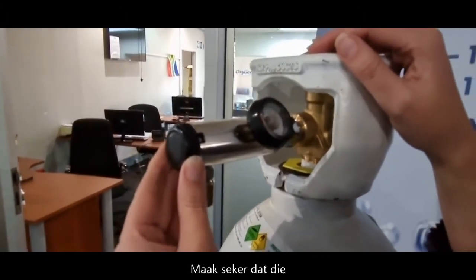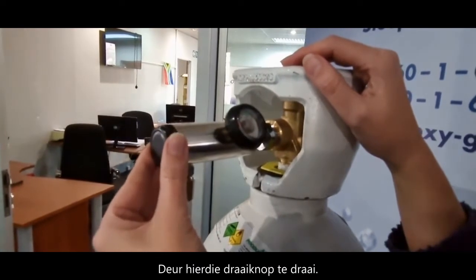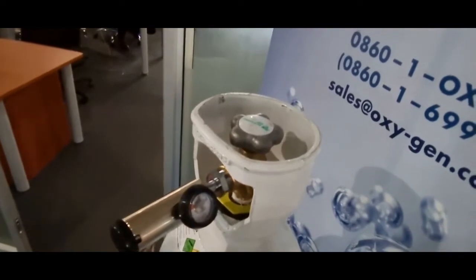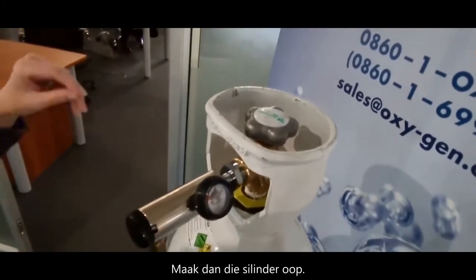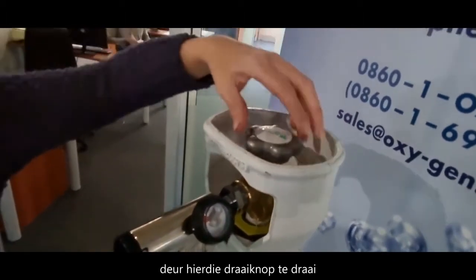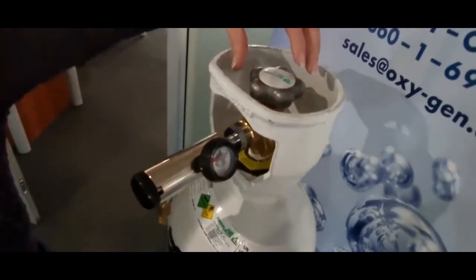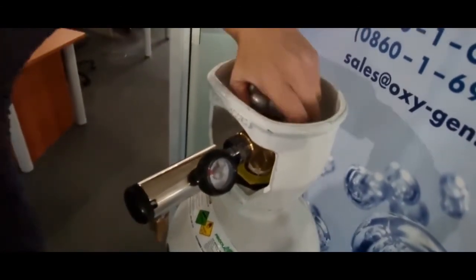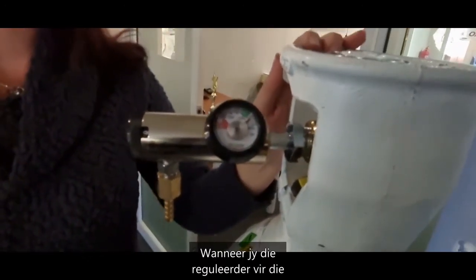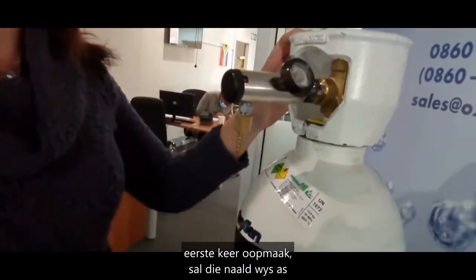Next, make sure that the regulator is on zero by turning this dial. Then open up the cylinder by turning like this. When you open up the regulator for the first time, the needle will show as full.